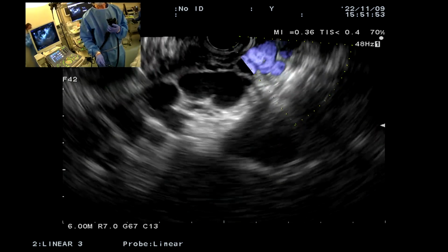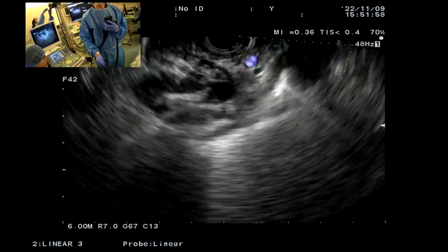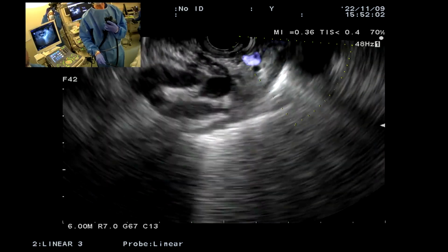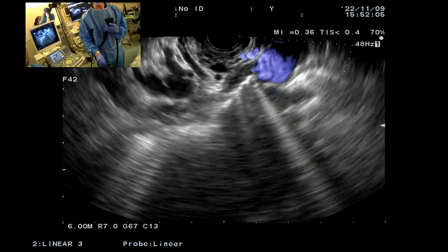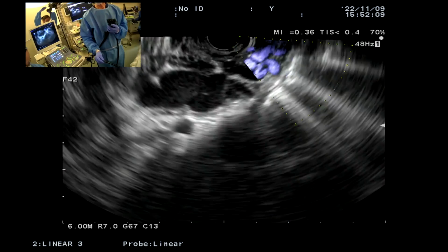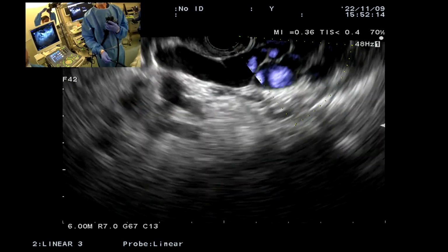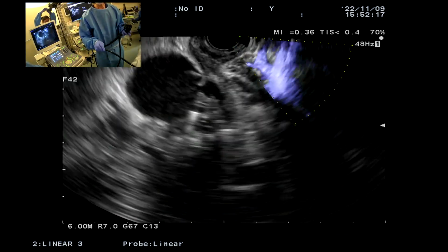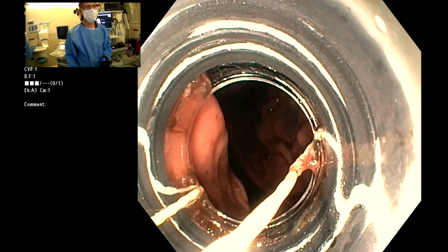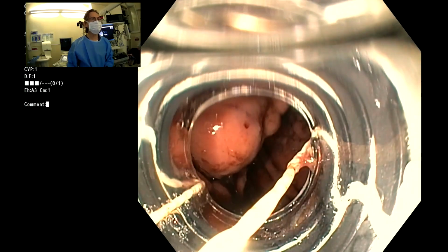And one option would be to obliterate the feeder vessels here that connect the collaterals outside with the esophageal varices with glue. That has been done. I've done it, and it's been reported to result in less recurrent bleeding. All right, so we're going to pull out and we'll band the esophageal varices.